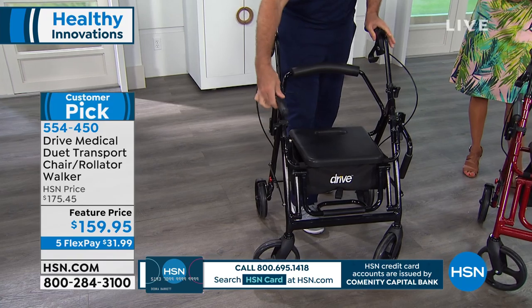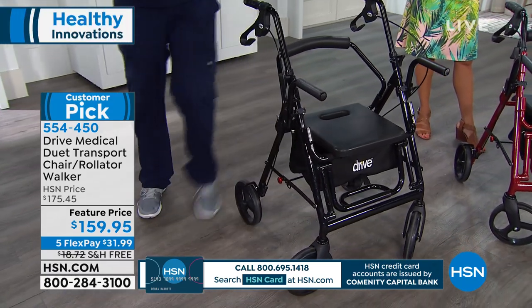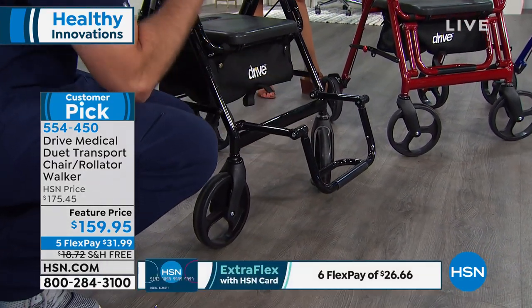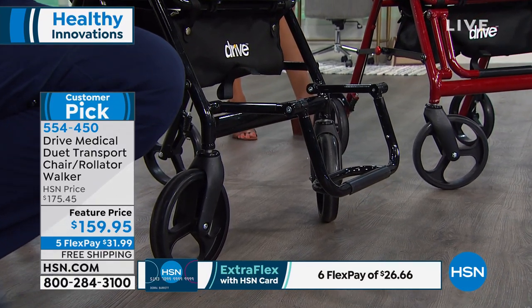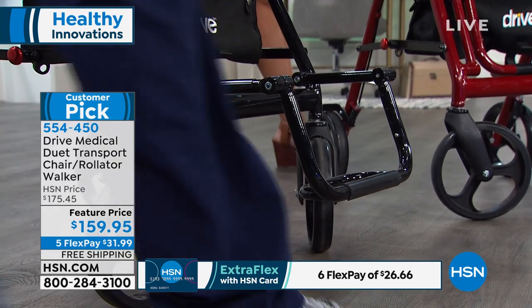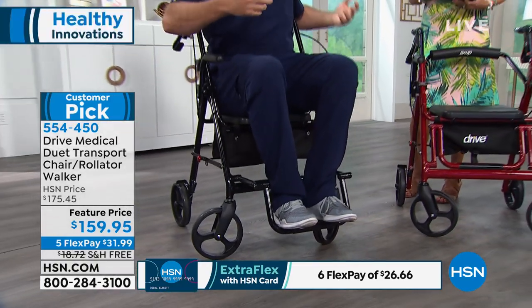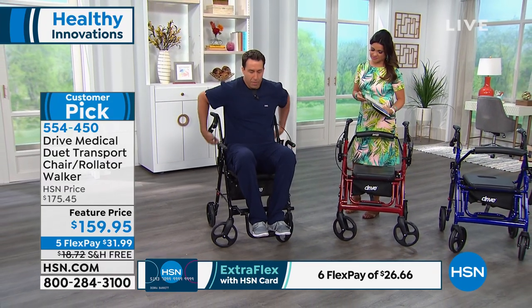I also have my padded armrests that come up. I can bring down my footrest, which is also height adjustable. We talked about wheelchairs and how heavy and clunky they are — they can be burdensome on caregivers. As I take a seat here in transport chair mode, you saw that in about 10 seconds I can convert this from a rolling walker into a transport chair.